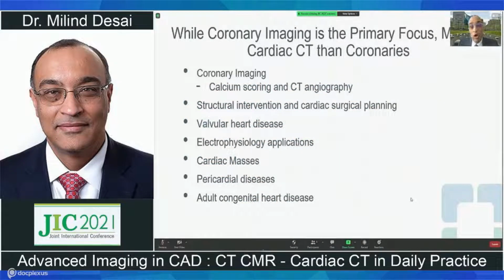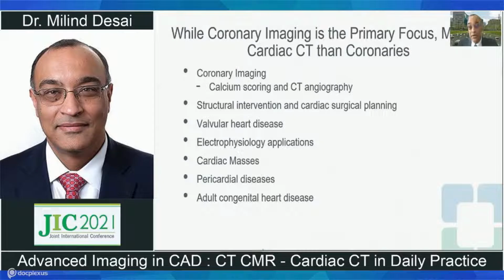So, while coronary imaging is the primary focus of cardiac CT, there's a lot more to cardiac CT than just coronaries. And that is the focus that I'm going to have. We will talk about how we can incorporate cardiac CT into our daily lives beyond the coronaries. But of course, the most important aspect of CT imaging is coronaries, where we can do not only calcium scoring using non-contrast CT, but also contrast-enhanced CT angiography.